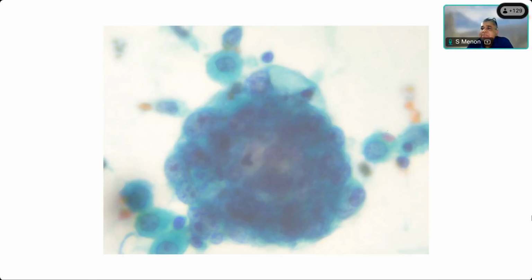So Joseph says it's atypical glandular cells. Hume says papillary cluster. And it's very good that you called it an FNAC. It actually brings up a good discussion point.